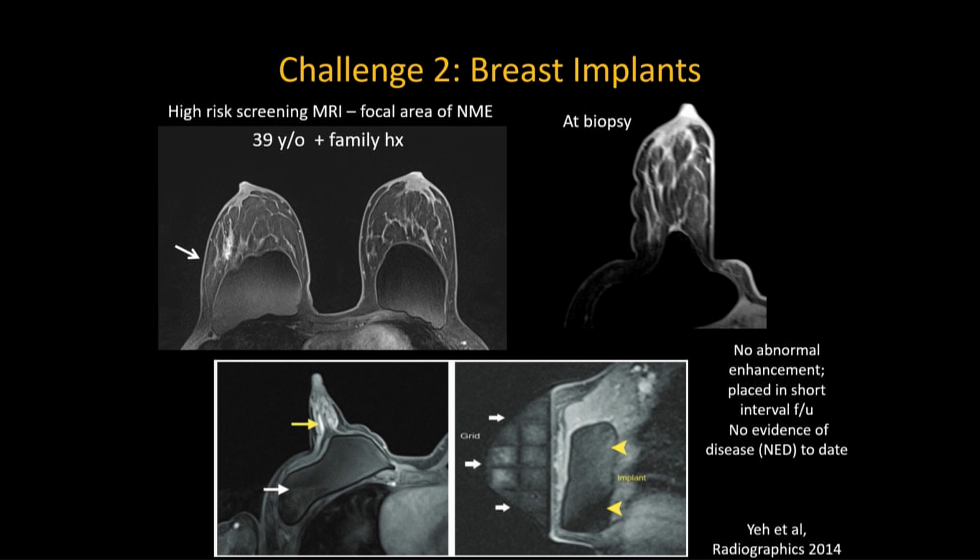And this is where it's incredibly important to work with your MRI technologists and make sure they are aware of breast MRI procedures. And so they push the breast implant out of the way, allowing for the grid to have the most amount of tissue space. And this will allow you to do a safe biopsy as well.